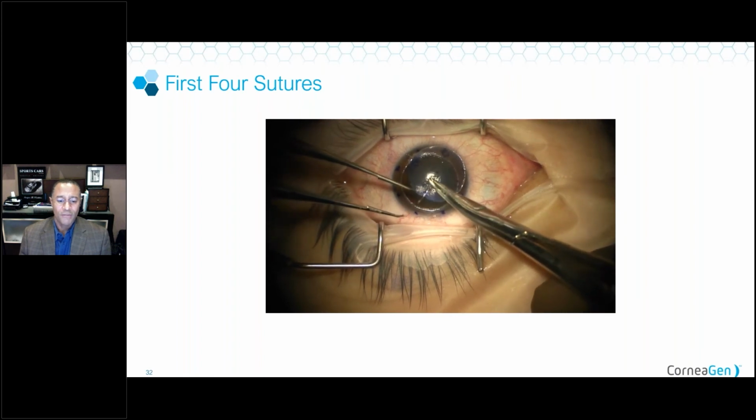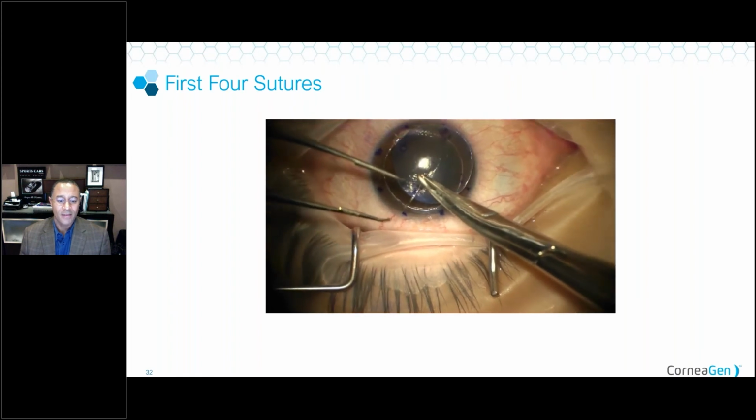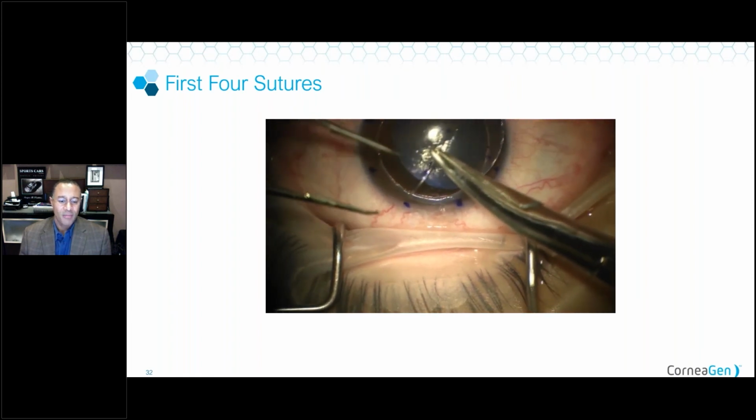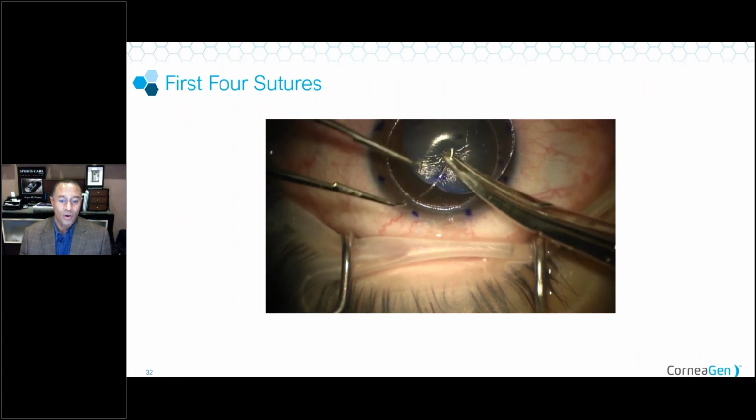We don't want to do a full through and through bite, because it doesn't tend to drive the donor tissue posterior into the bed. And you can have problems with the epithelium not wanting to grow over the donor.